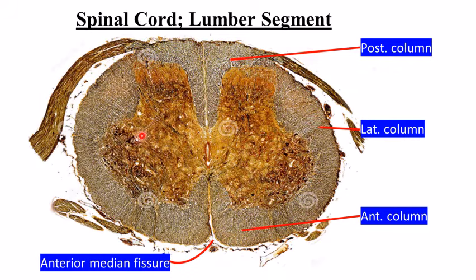Again, dear students, this is spinal cord. Why? H-shaped gray matter. What level? Lumbar. Why? Look, the posterior horn is thick and parallel to each other. Look at the anterior horn, thick as well as parallel to each other. The central canal is more anterior. The white matter decreases a lot.